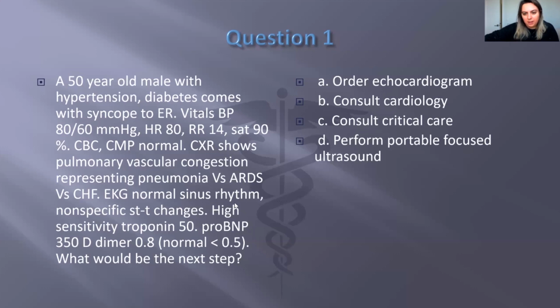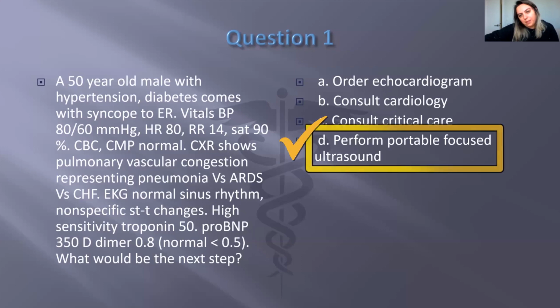All right, and here are the results. Let me know if you can see it, Dr. Mavani. Yeah, so this is very good. 71% were right. All of them can be done. Echocardiogram can be done, but at least in my place, it takes about an hour or more. Especially at night, we have to call the echo tech in, or you may have to get the machine down and do the full echo. And that's really a tough job in the situation of shock.